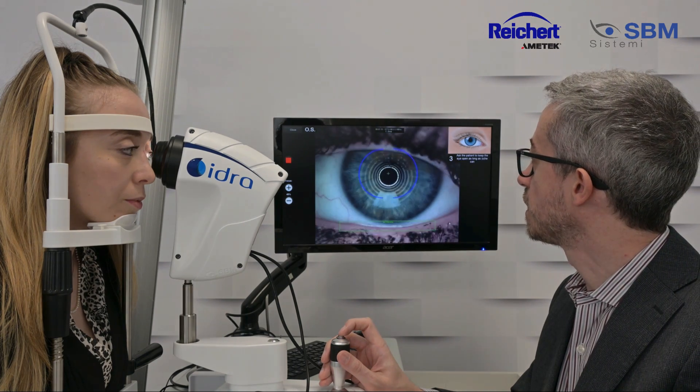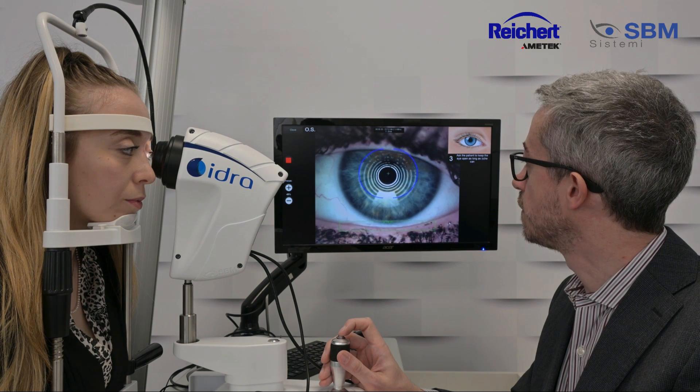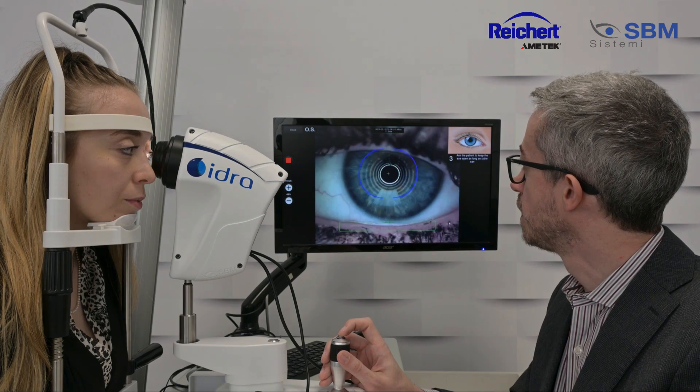Double blink, keep the eye open, keep the eye open, try not to close, try not to close until you can. And it's done.